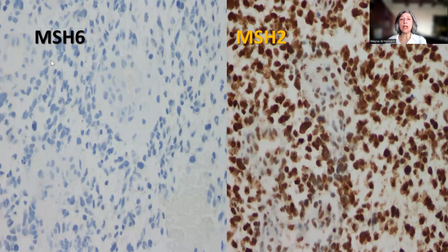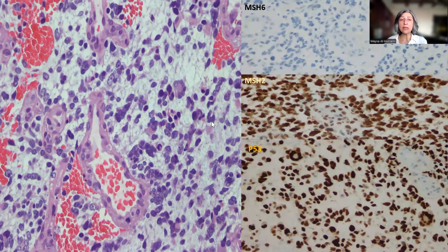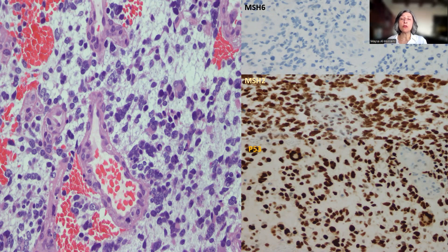Once we identify deficiency of MSH6, we perform MSH2 immunohistochemistry, and here there is retention of nuclear staining in both the normal and tumor cells, meaning there is no mutation in MSH2. There was also no mutation in PMS2 or MLH1. This high-grade glioma shows very prominent microvascular proliferation and multinucleated tumor giant cells with acidophilic cytoplasm, which are very characteristic of mismatch repair deficient high-grade gliomas, in particular constitutional mismatch repair deficient tumors.